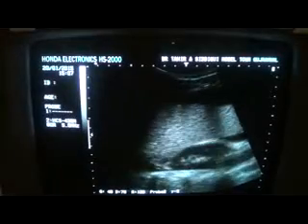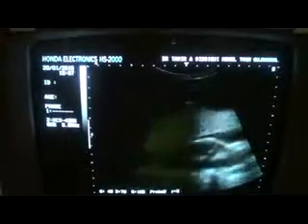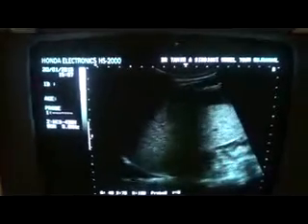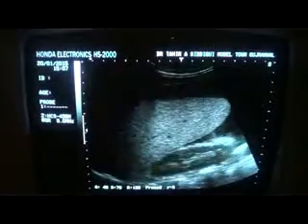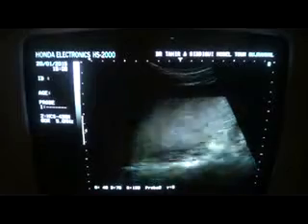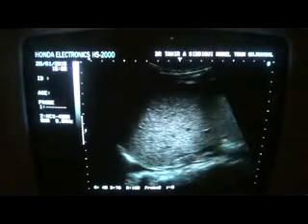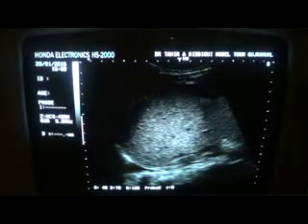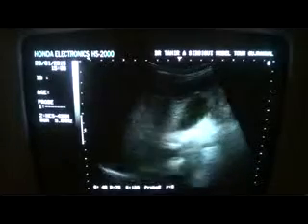Okay, now please do consider one thing while you are performing this scan: if you see fluid in both pleural spaces as well as in the abdomen, surrounding the outer surface of the liver, then be sure to distinguish them. This is the pleural effusion, and this is the ascitic fluid. Fatty liver parenchymal changes are seen.